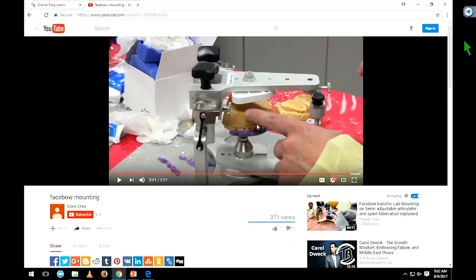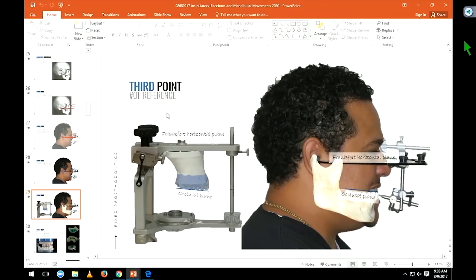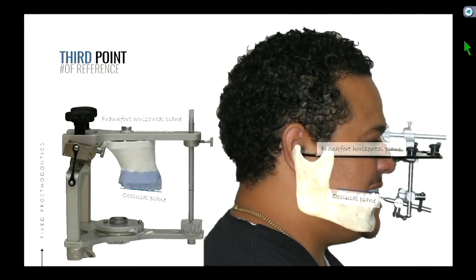Once the maxillary cast is indexed into the bite fork and mounted with plaster, this setup mimics what the patient has. The purpose of a face bow measurement is to orient the patient's maxillary casts relative to the hinge axis. So all the movements the patient makes — opening, protrusion, lateral — will be very similar to what the patient actually does, because the cast is mounted in the correct spatial relationship.